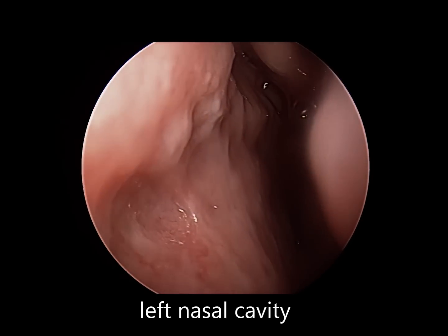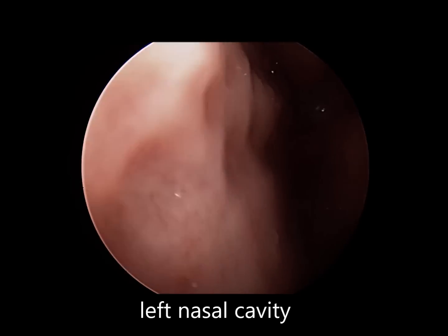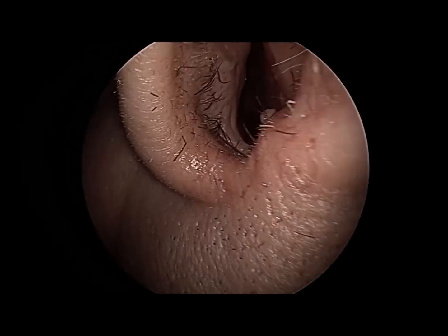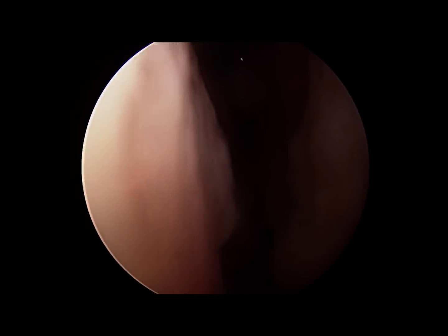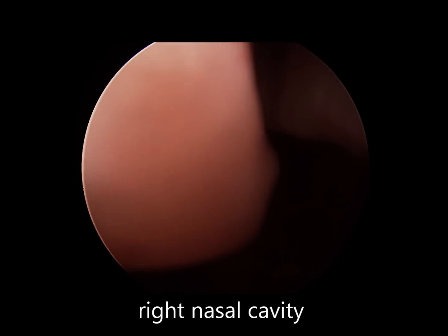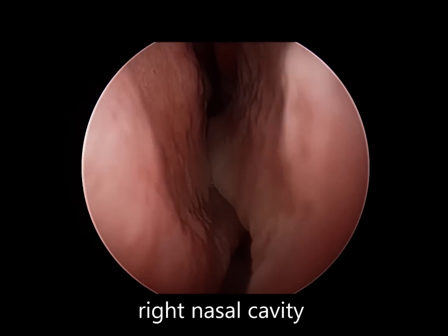This is a view of the patient's nasal cavity before we've operated. On the left side, you see kind of a dimple towards the septum inferiorly, and on the right side, opposite that dimple, we have a very significant septal spur that pokes out into the side wall of the nasal cavity.